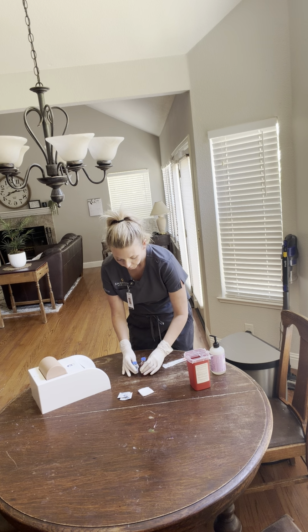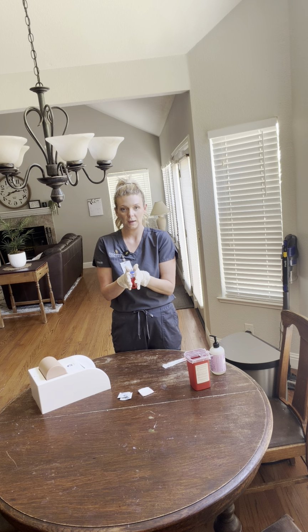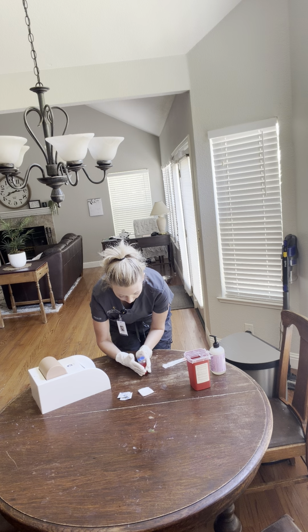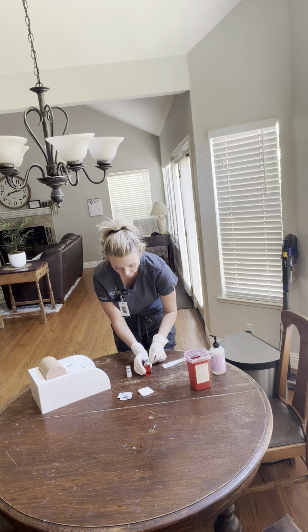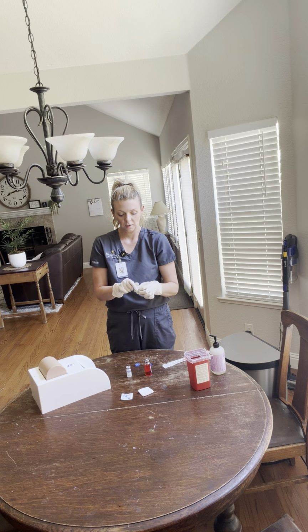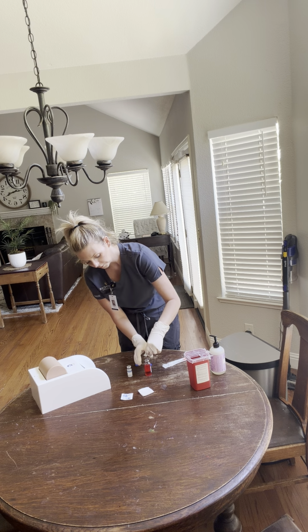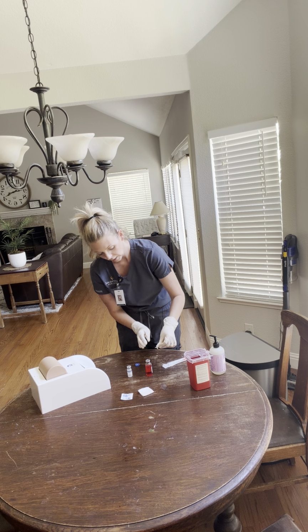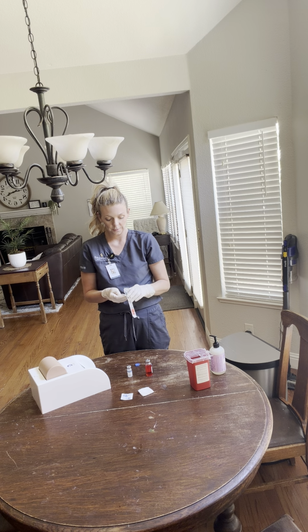So the first thing I'm going to do is I'm going to pick up my vials and I'm going to roll them in between my hands to slightly warm the medications and to mix them as well. So there's that. I'm going to uncap my vials here and get an alcohol swab. I'm going to clean the tops of each vial, and I'm going to let those air dry. And as those are air drying, I'm going to get my syringe ready.